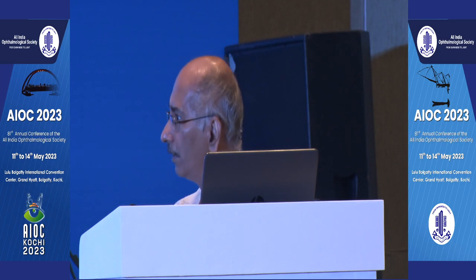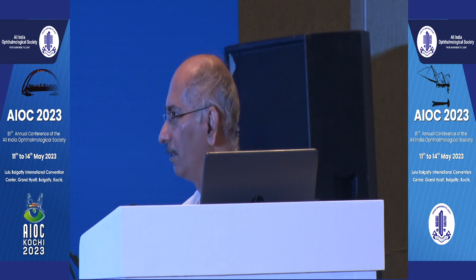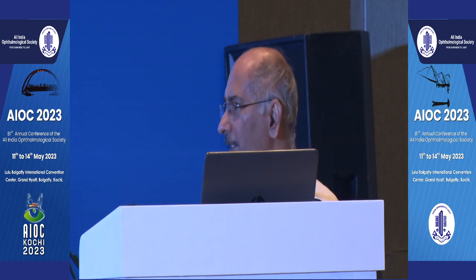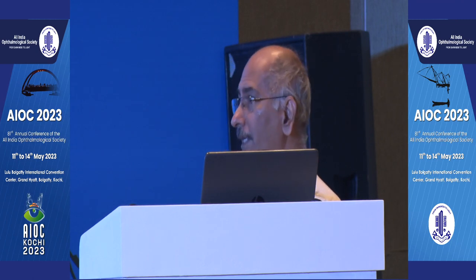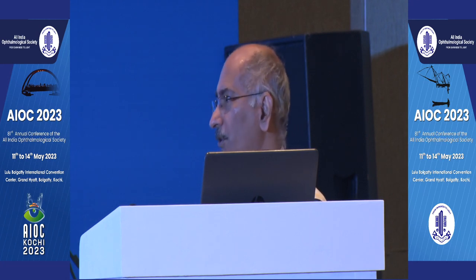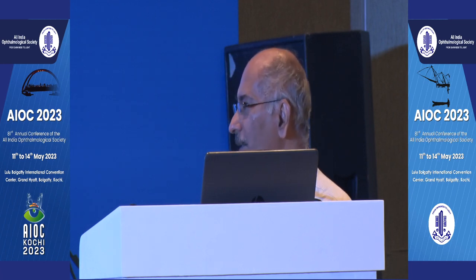Now the retina is attached, under oil. It's about the second week now. But I'm sure it's going to re-detach eventually. There are going to be areas of puckering, and I'll have to go in again. So we'll see at that time. But it will be a quieter eye. The risk of bleeding at the time of retinectomies will be lesser. There will be more mature membranes present to be removed, if any.